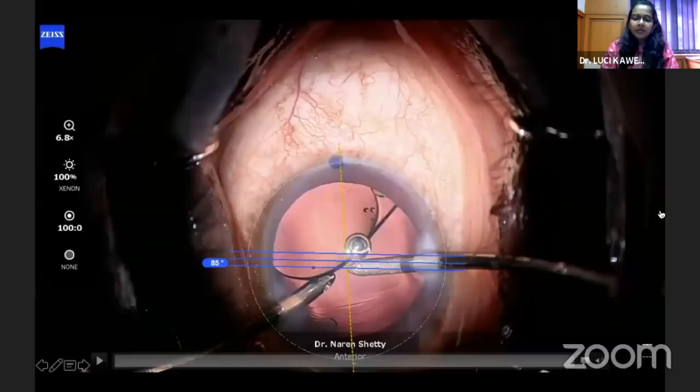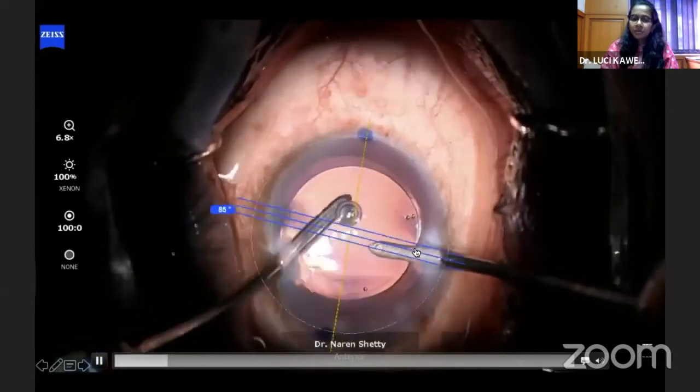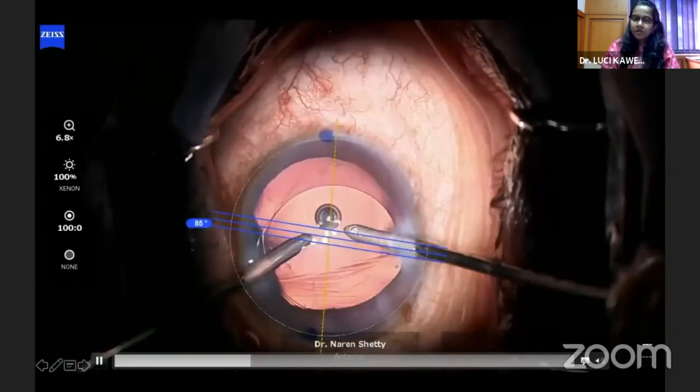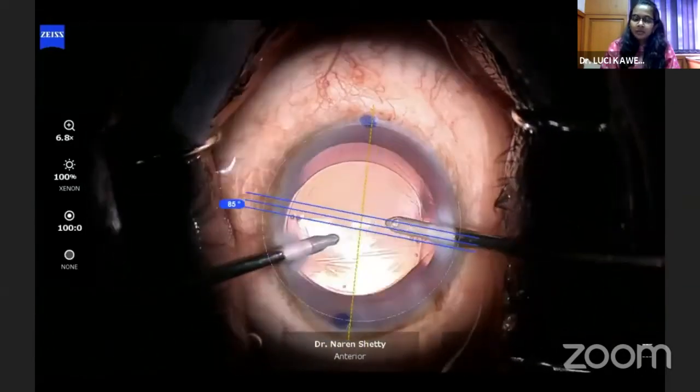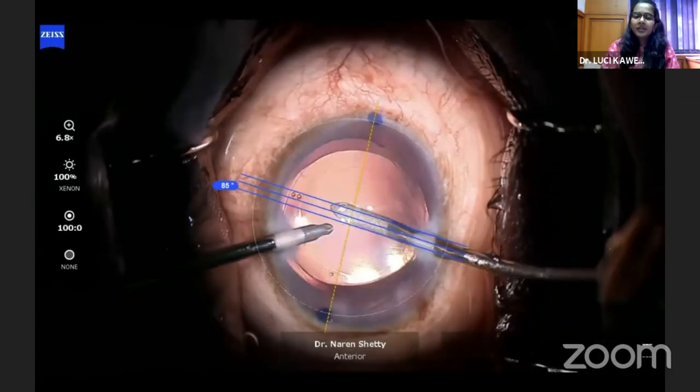When you do that, you will have the toric markings displayed. You can have this display on throughout your surgery or turn it on only while placing the IOL. As you can see, the 0–180 mark done for reference corresponds exactly with the 0–180 mark that appears on Calisto. The final marking can thus be accurate. You can also see that the 0–180 mark made with a marker pen is not a single-degree axis — it extends up to five degrees — so using only a manual reference mark for toric alignment could introduce errors of five degrees or more.